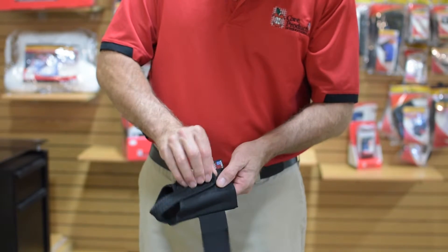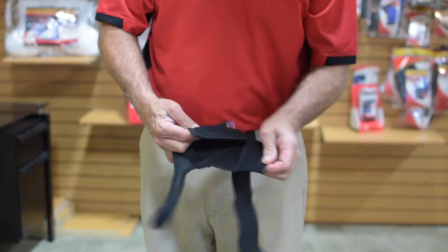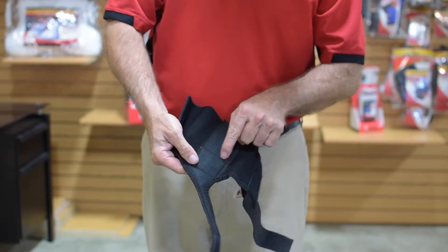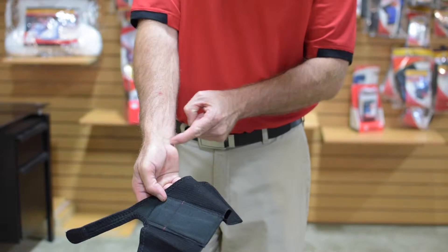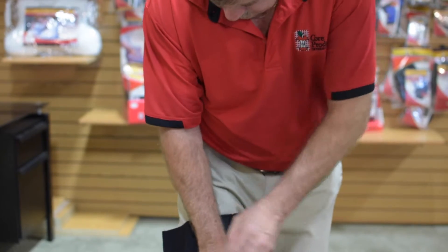The Core Products Reflex Wrist Brace will help relieve symptoms of carpal tunnel syndrome. This popular wrist brace helps provide comfortable relief from repetitive motion discomforts and helps treat post-surgery and post-cast situations. Range of motion is restricted but not eliminated.